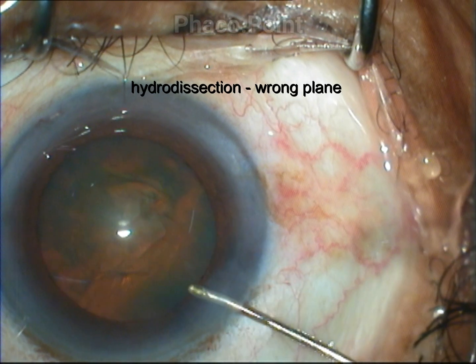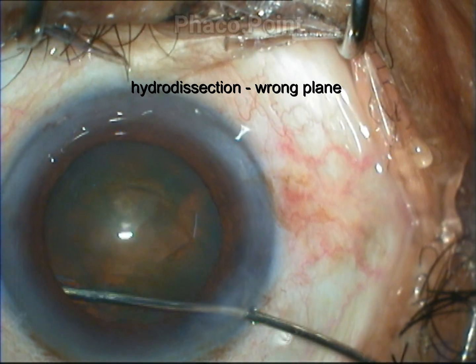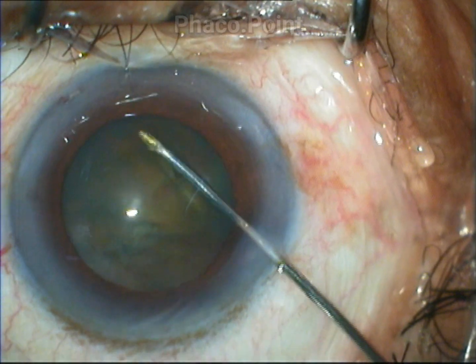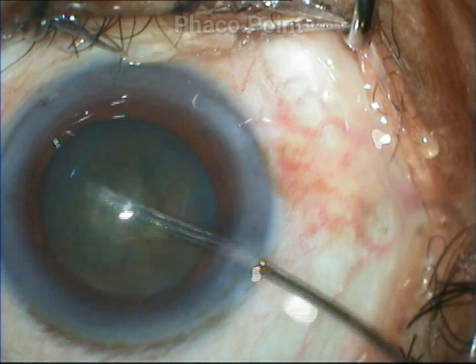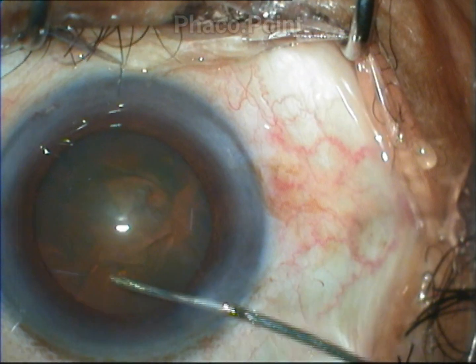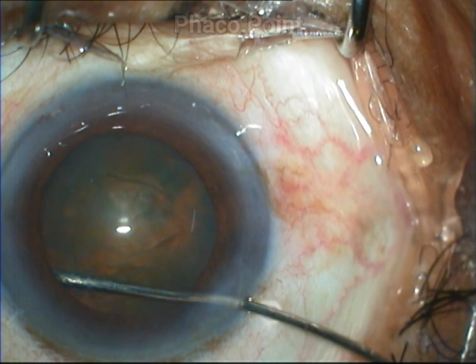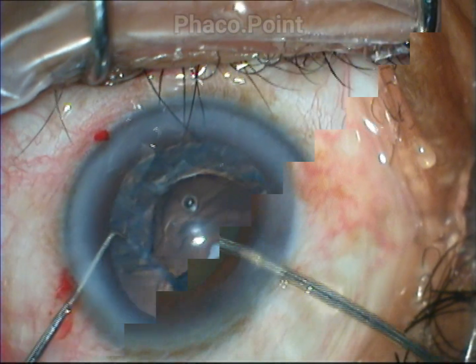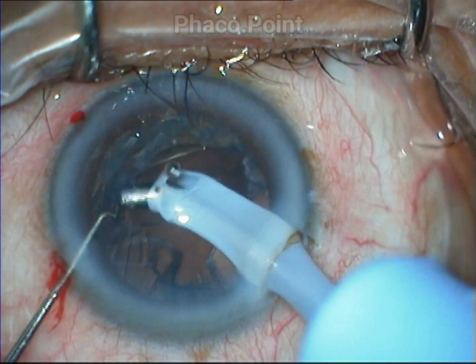In the first case, my mistake is that I perform hydrodissection at a much deeper plane than required. In this case, I don't create a cortical cleavage hydrodissection but instead inject the fluid somewhere between the epinucleus and the cortex.